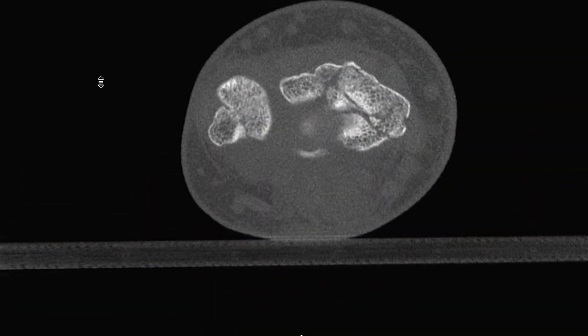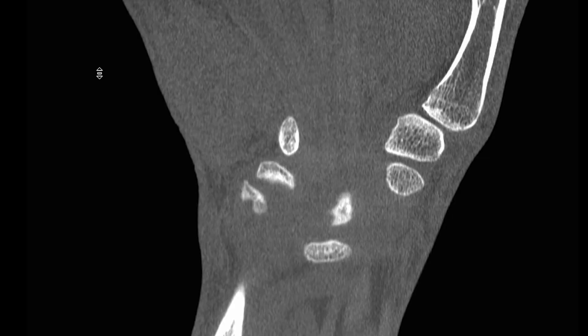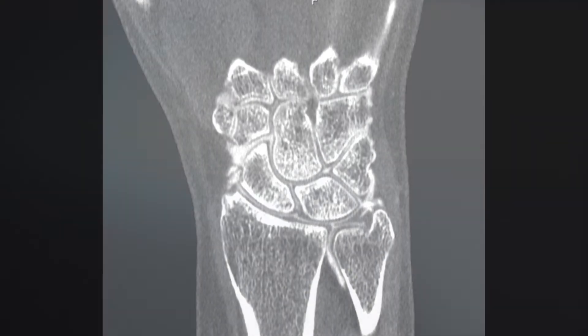Perform point-of-care assessments for suspected distal radius fractures, scaphoid fractures, and more. With a local contrast injection, the TFCC can be visualized as well.